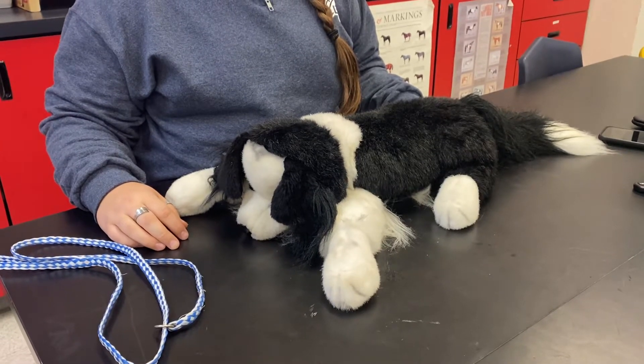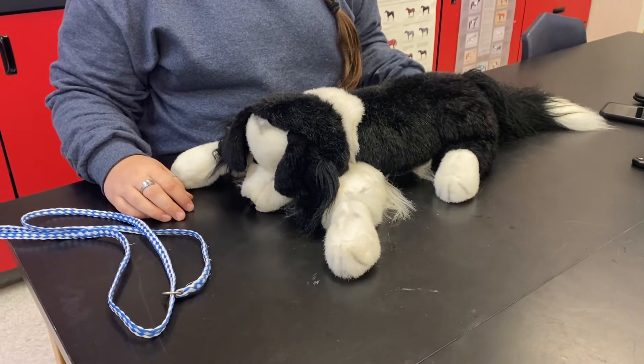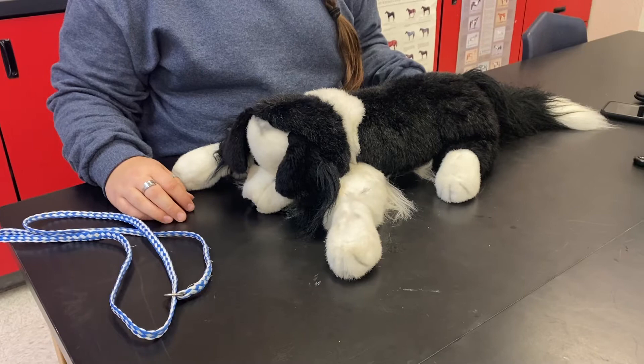Today we will learn how to restrain a dog for cephalic venipuncture. First, the student places a noose leash on the dog.